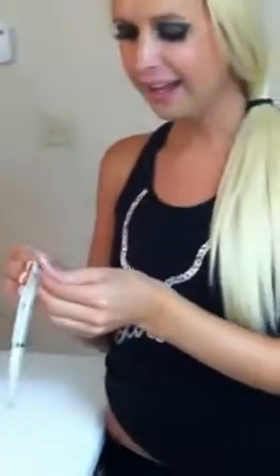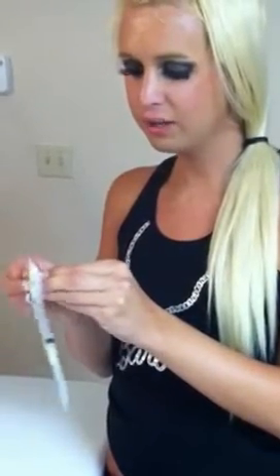So here's what I have. Right now I have the Progynon Depot, which is just another form of the Estradiol Valerate injections. I've got my needles. Right now I'm using a 1.5 inch 20 gauge. I know that you can use a lot shorter needles, but I was told by one of the trans girls that the 1.5 inch is okay.